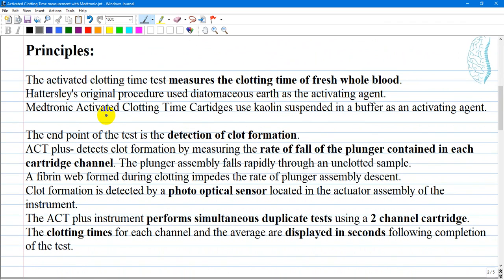The activated clotting time test measures the clotting time of fresh whole blood. Hattersley's original procedure uses diatomaceous earth as an activating agent. The Medtronic activated clotting time cartridges use kaolin suspended in a buffer as an activating agent.